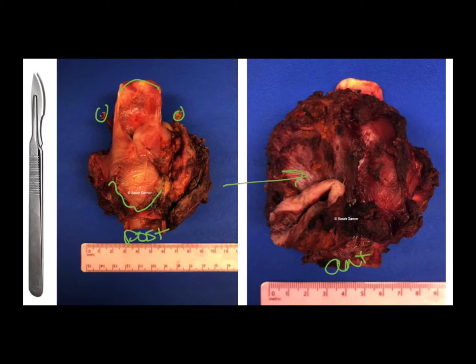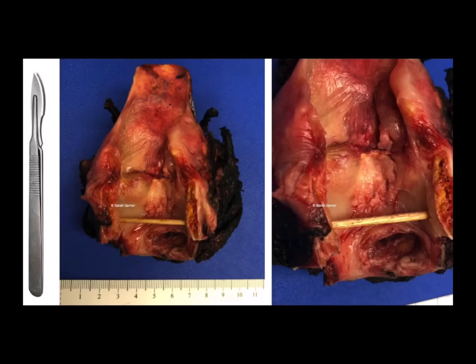And then on the anterior side, you can see that there's a lot of soft tissue. There's an opening for the tracheostomy. So this overall is a really nice specimen. Now, opened it up, and here you can see it really doesn't look too bad, right? But as you're probably aware, with a lot of these head and neck cancers, they can be very endophytic. And so sometimes when you first look at it, it doesn't seem like it's going to be that bad. But then once you cut into it, it is everywhere. And that's exactly what happened in this case.